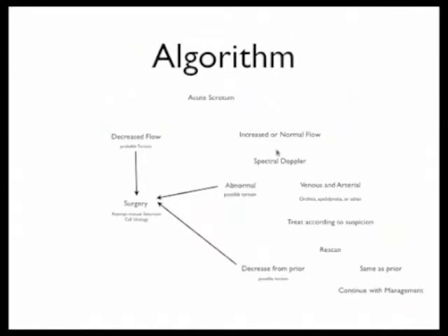Yeah, exactly. And that's a great point. You can just totally lump those patients into urology consult and radiology performed ultrasound. That's not really a problem. You're still going to catch a very large percentage. I mean, the highest percentage of these acute scrotums is epididymitis. So you're going to see increased flow. I think that's going to be a minor percentage of your patients that are completely normal.